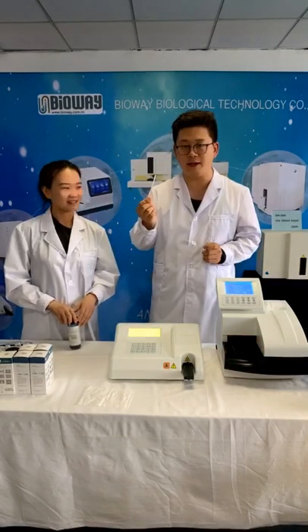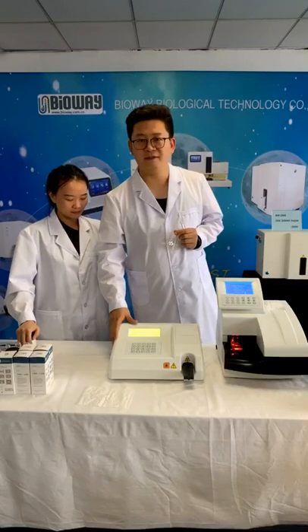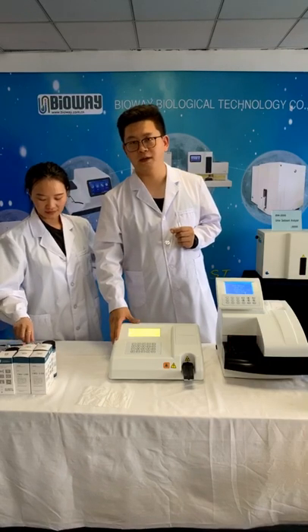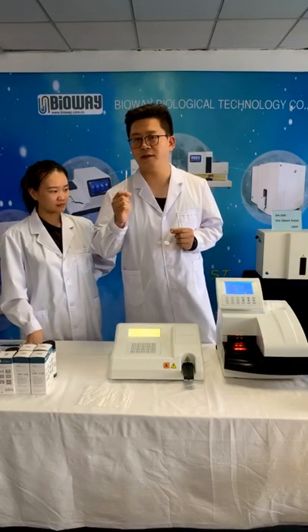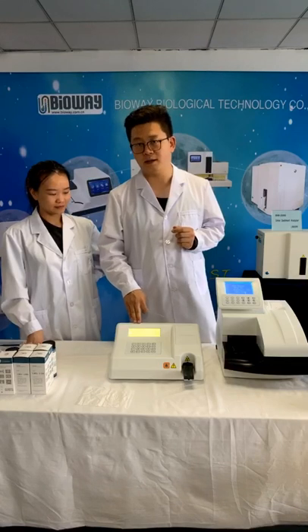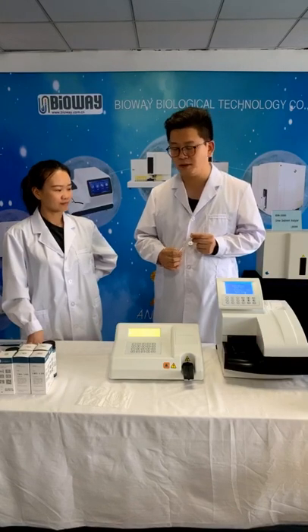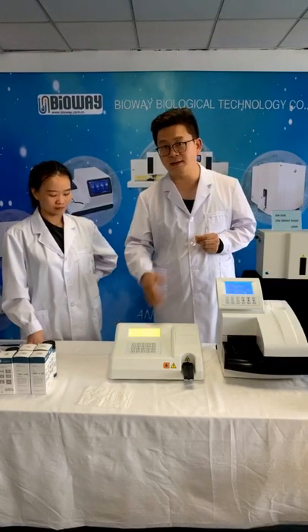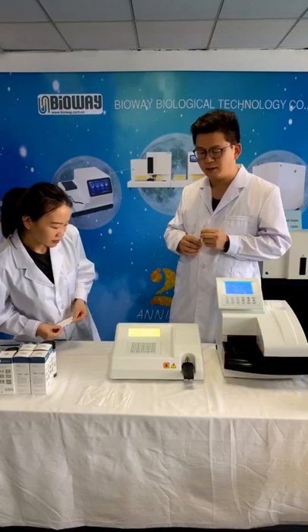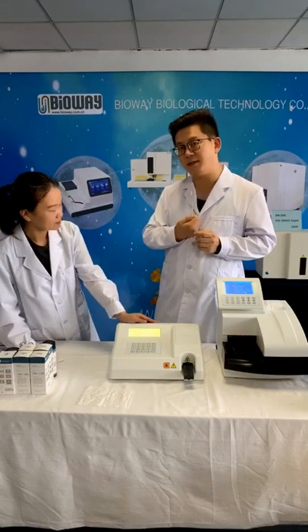This is a 10H. For BW200, there is a single option for the type of urine strips. If you purchase the URS 10H, this machine can only test URS 10H. They have a single mode, so you have to figure out which urine analyzer matches what kind of urine strip. They must be matching. This shows 10H, and this is 10H.